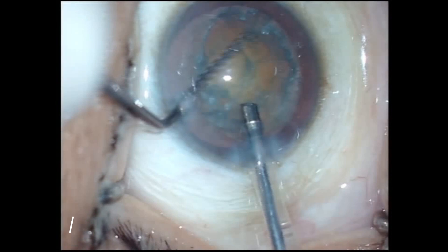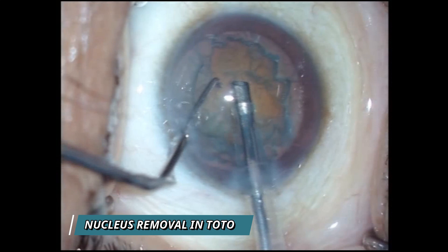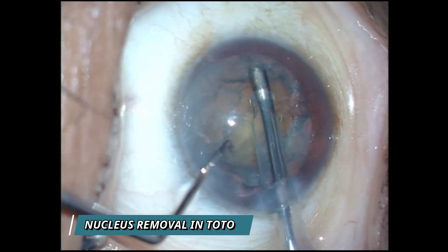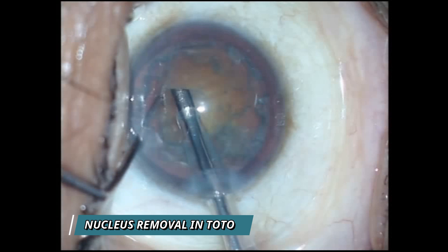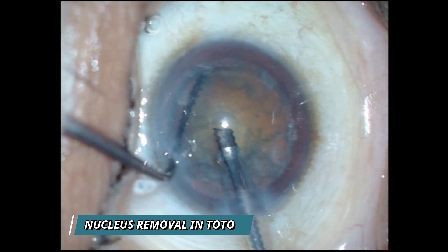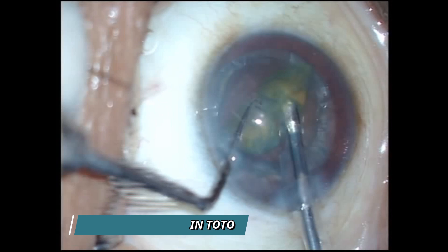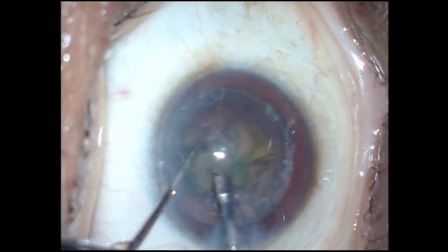Now watch the second video. Again, we remove the epinuclear plate between the anterior capsule and the anterior surface of the nucleus. Once the full 360 degrees of the epinuclear plate has been removed, we prolapse the nucleus in total — without dividing it — into the central safe zone. Watch how easily it collapses into the central safe zone. No phaco emulsification is done in the peripheral unsafe zone. We divide the nucleus into two and emulsify and aspirate with vacuum settings of 450 mmHg and a flow rate of 36.